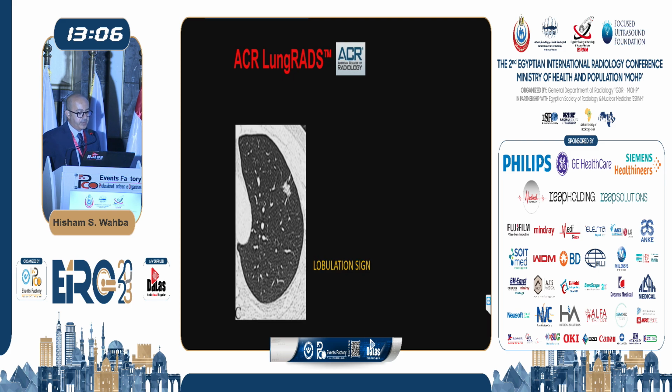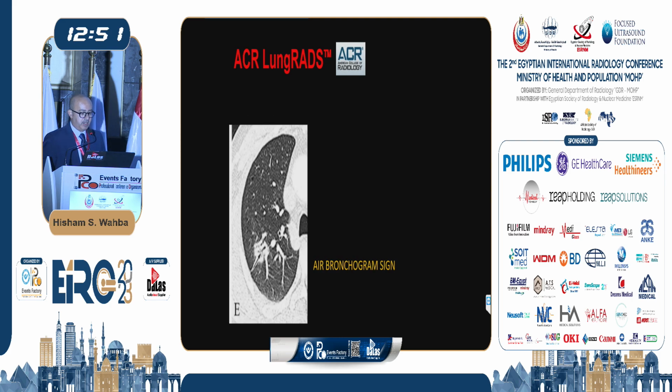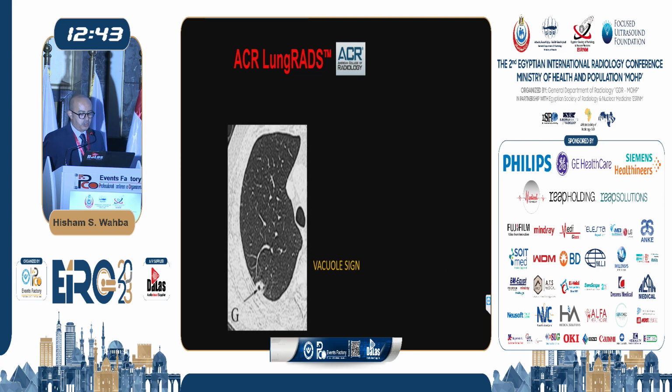The spiculated sign. The lobulated sign, again, is a suspicious sign of malignancy. The bronchial cutoff sign, which is a very alerting one, when you have a bronchus or bronchiole that has a cutoff ending or appearance, it's most likely a malignant one. Again, the air bronchogram sign, the tumor vasculature sign. So all these are signs on CT that we can see in each and every single nodule.